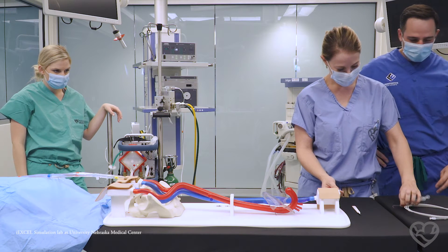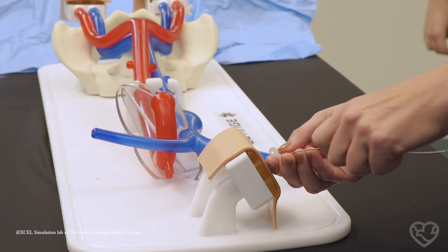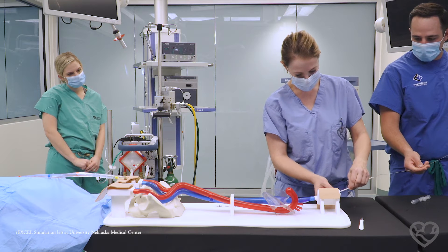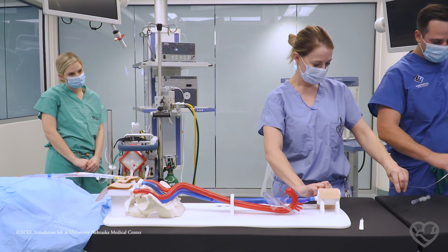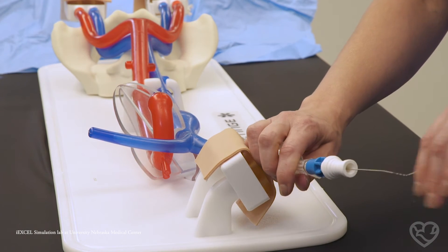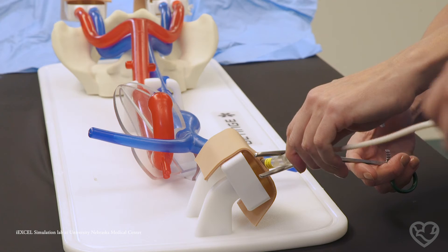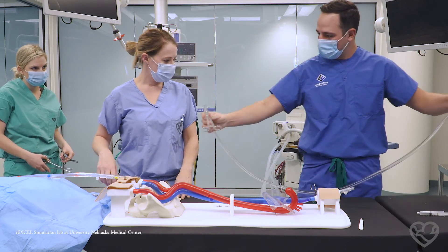Standard venous access is obtained in the right internal jugular vein. Using Seldinger technique, the vein is sequentially dilated to the size of the venous cannula which will be added to the system. The ECMO flow may be temporarily decreased during dilation of the vessel to avoid entraining air into the circuit. The perfusionist will be prepared for such a scenario through common communication. The entire team will also be prepared for a brief period of separation from the ECMO circuit, which may include titrating inotropes or pressors, adjusting ventilator settings, and ensuring all parties are aware of and ready for this brief separation.